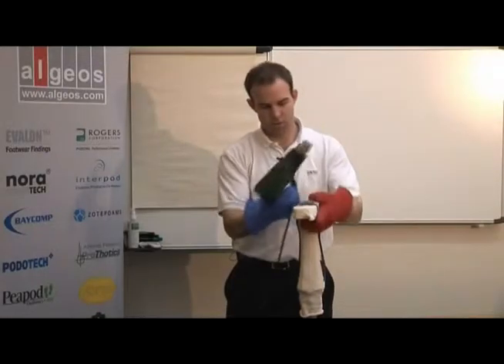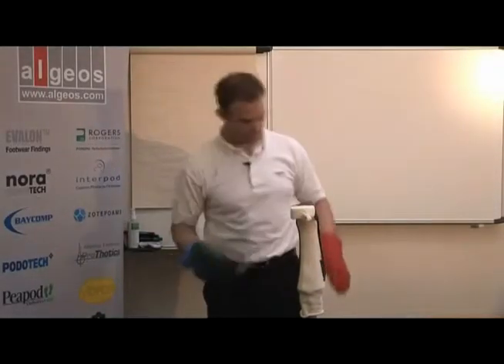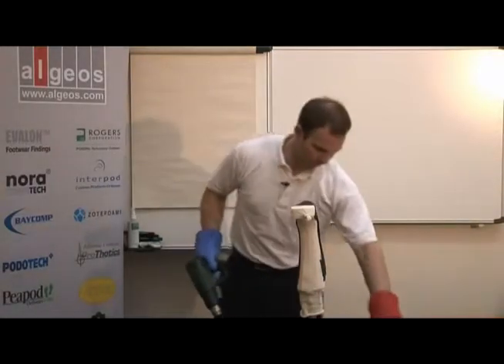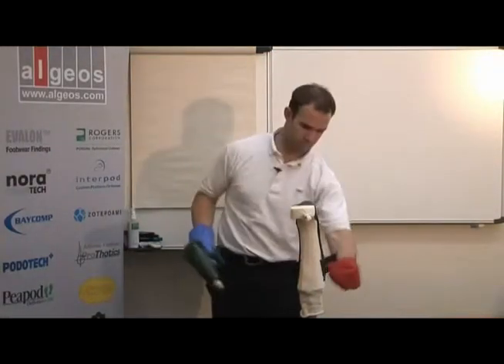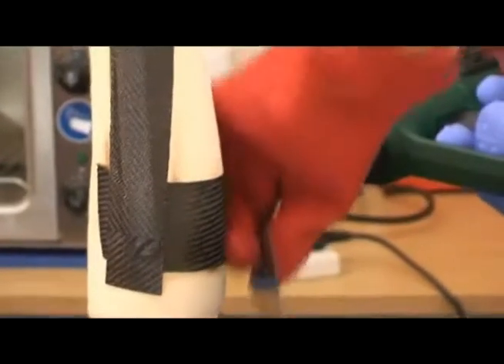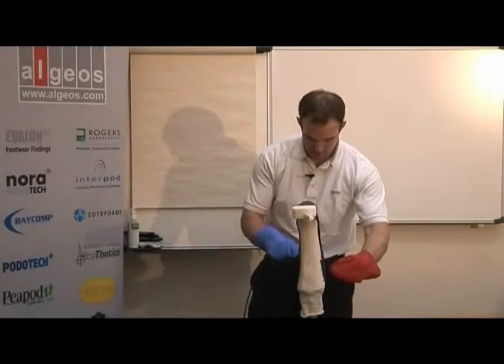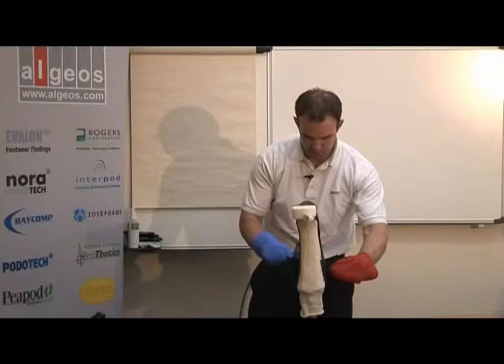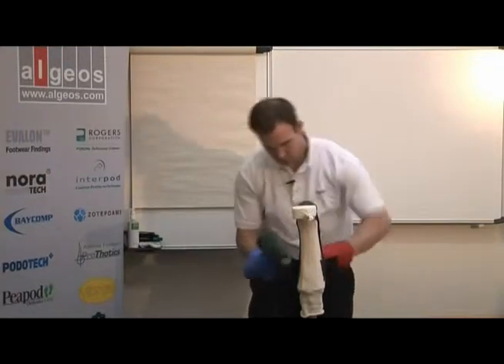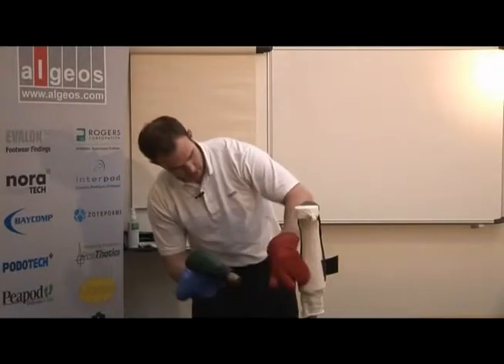It's important to make sure it's smooth and has a good fit on the mold. Then after I put my last piece on, I'll let the material cool down. Then I take it off and grind it.